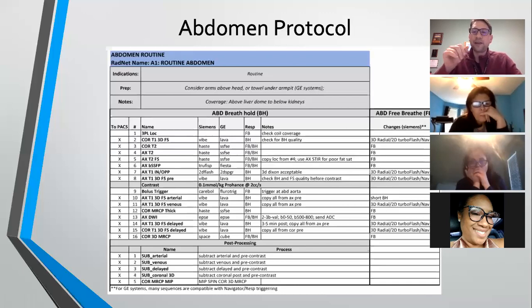So keep vein open is something some people like to use to prevent a vein from blowing, or from scaring the patient when that contrast initially goes in. Some techs just don't even like to mess with it, so they don't even turn it on. Personal preference. I like to use the KVO just because I think it's a little bit more comforting for the patient.